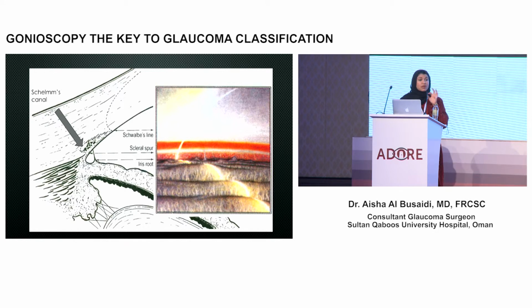However, sometimes you have deposition of pigment at or anterior to Schwalbe's line, and that would be known as Sampaolesi line. If you cannot visualize Schwalbe's line, or you have difficulty with that, the way to really detect where it is is to use the corneal wedge technique, where you off-center the slit beam, creating two corneal light reflections, and they meet at the point of Schwalbe's line.